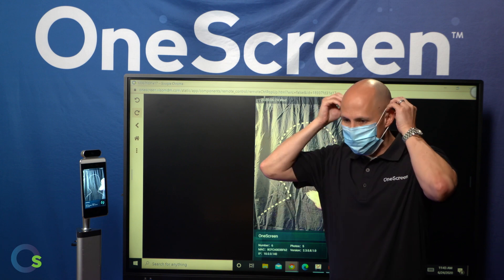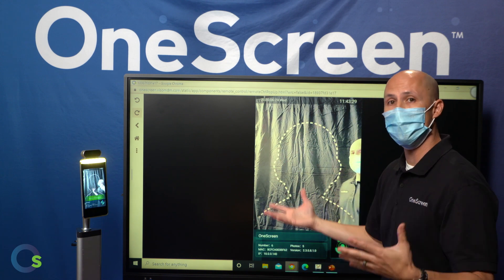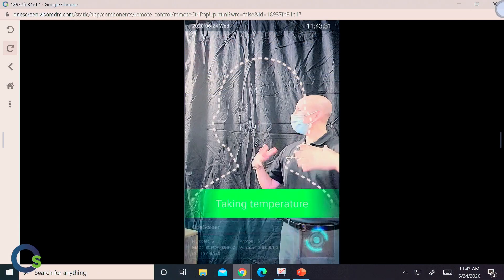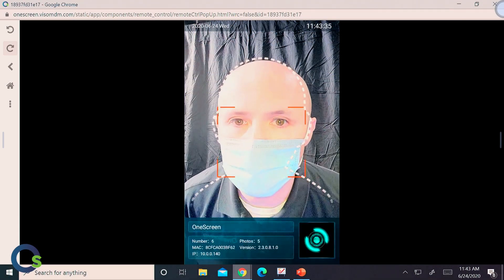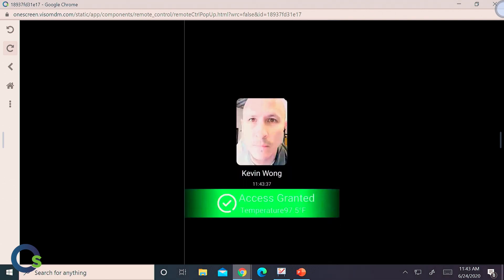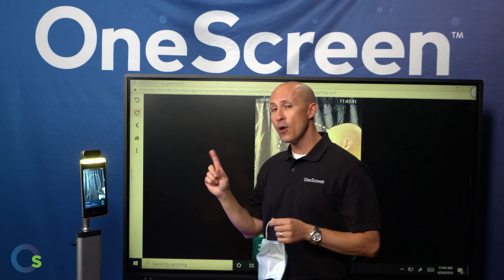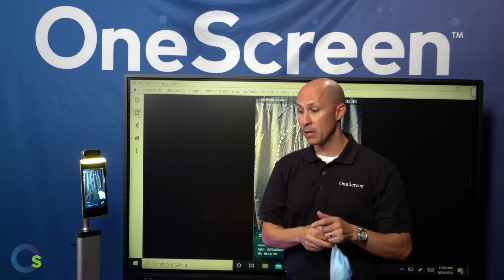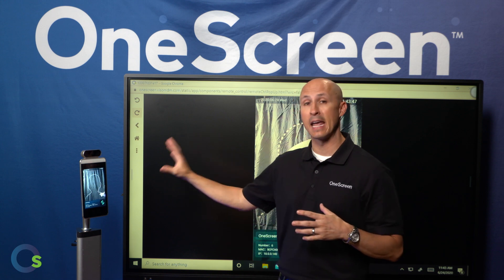So what I'm going to do is put my hospital-grade blue mask on, which is preferred. I'm now going to re-enter the screen. As I walk into this, again, red dot right on my forehead. Because I have my mask on, it granted me access. What you will notice is that even though I had my mask on covering most of my face, it still was able to facially recognize me as I am in the database.